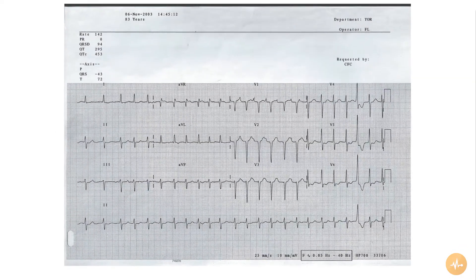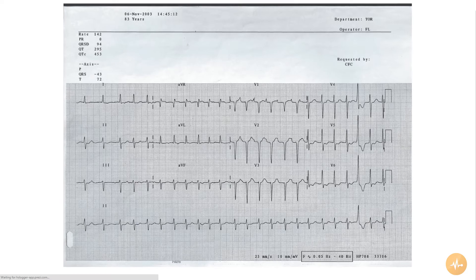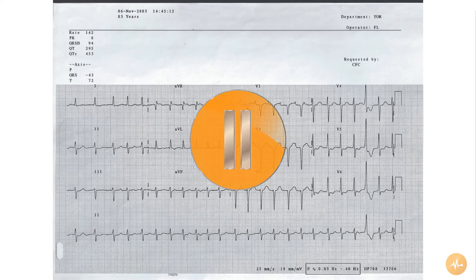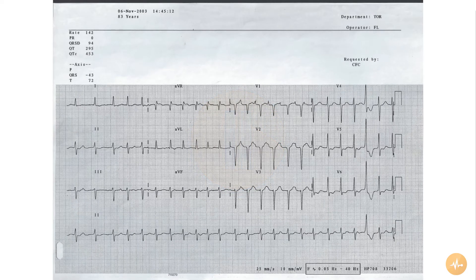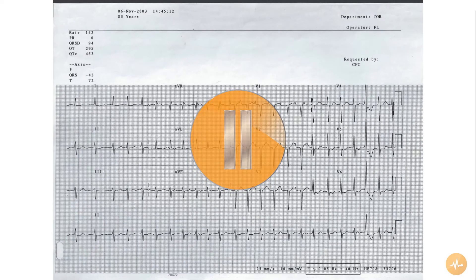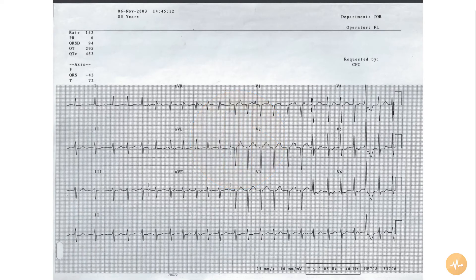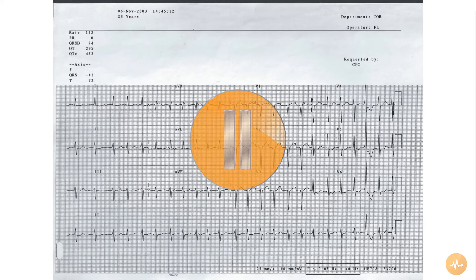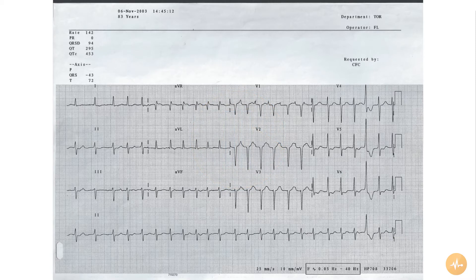This is the ECG of an elderly patient with palpitations and chest pain. Pause this recording now and interpret the ECG on your own before pressing play again to hear me interpret the ECG.